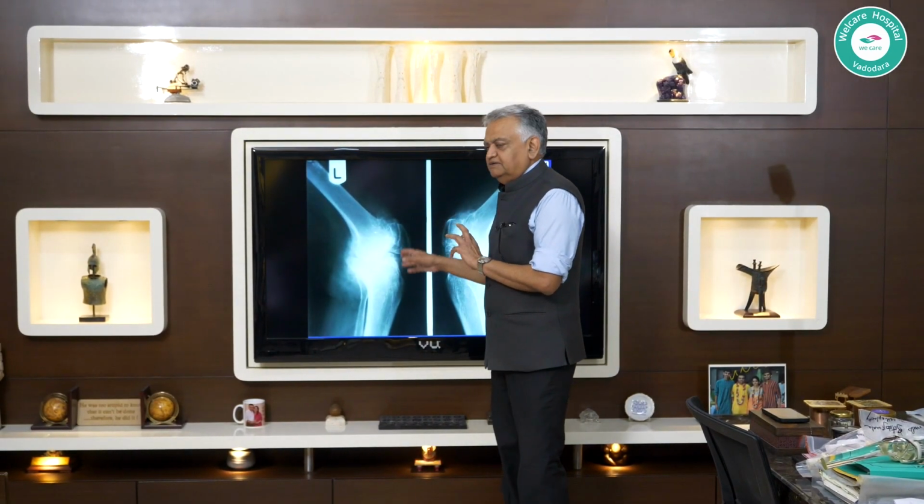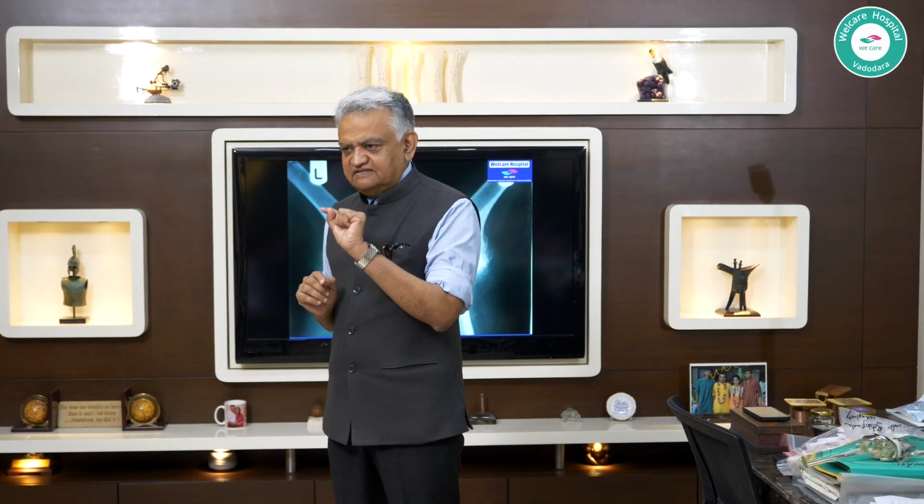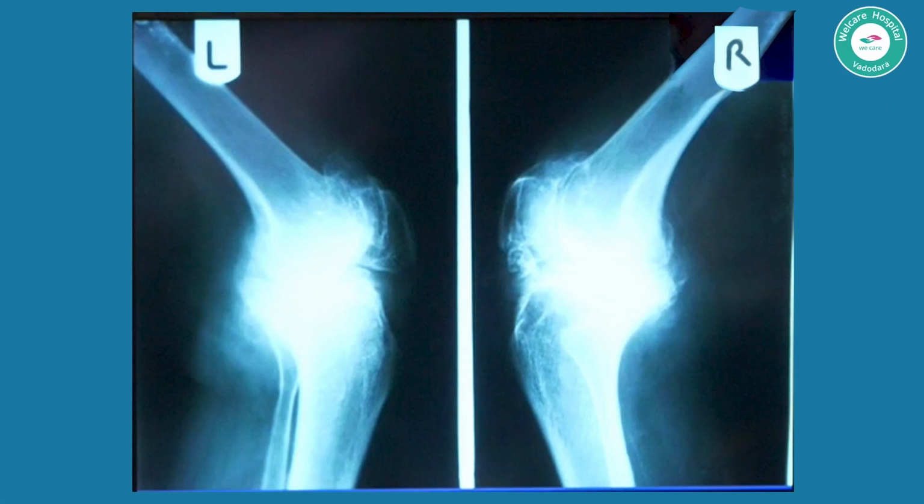So the alignment part, the navigation, what does a navigation do? This has triggered up from your question, how do you do that? Navigation doesn't have that confusion. Why? Because it has taken the midpoint of the center of the head of the femur, and then the midpoint of the knee, and the midpoint of the ankle, and then it has been told, bring them into a straight line.